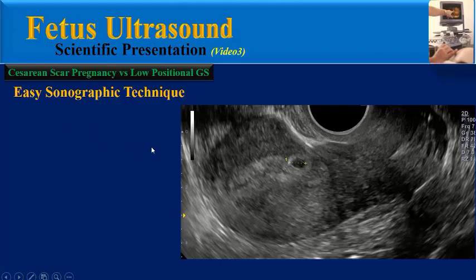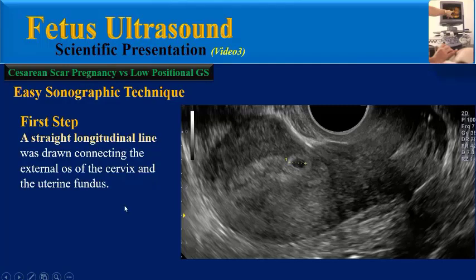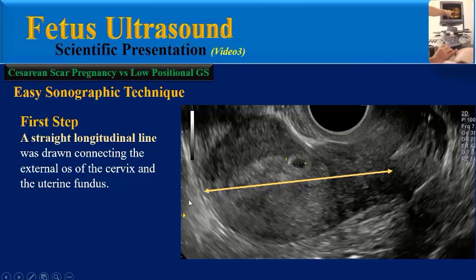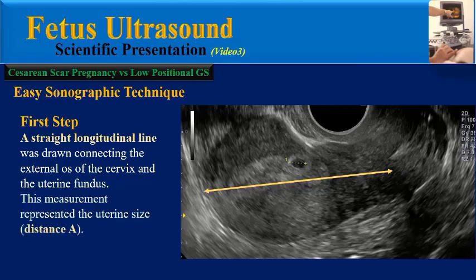In this technique, the first step is to take a complete longitudinal view of the pregnant uterus by transvaginal ultrasound. A straight longitudinal line is drawn connecting the external os of the cervix and the uterine fundus. This measurement represents the uterine size, referred to as the A line.